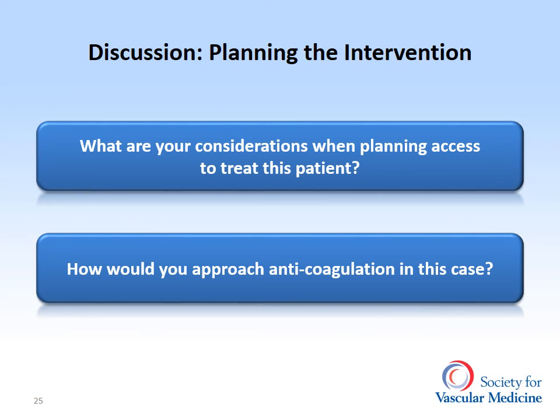There would be lower bleeding with the radial access, but higher with the brachial access when compared with a common femoral artery approach. An upper extremity approach would avoid contralateral iliac tortuosity. This approach is sometimes limited by arm and operator positioning and by equipment reach.